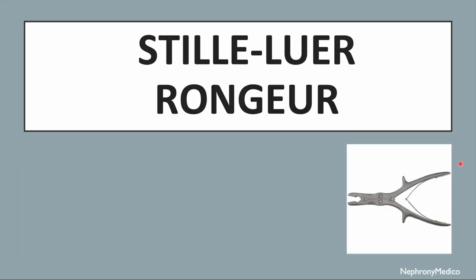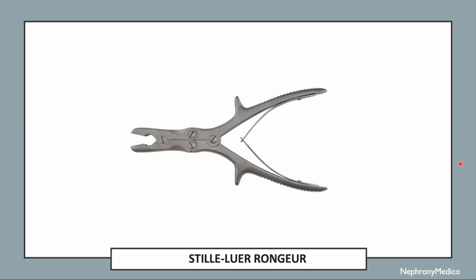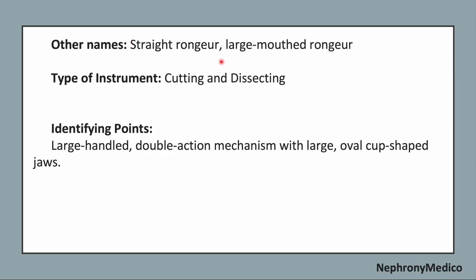Let's talk about the Stille Luer rongeur. This is a picture showing a Stille Luer rongeur. It is also known as straight rongeur or large mouthed rongeur. It is a cutting and dissecting type of instrument. Now, identifying points: it is a large handled double action mechanism with large oval cup shaped jaws.